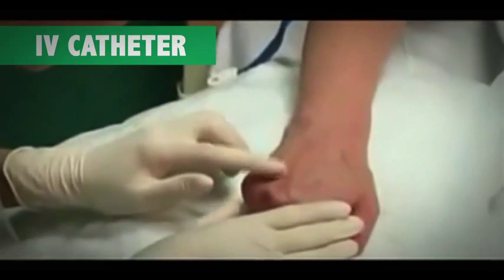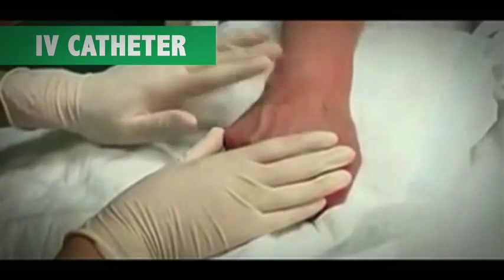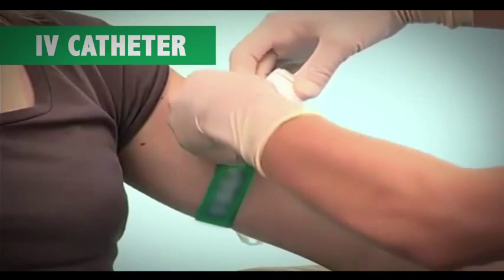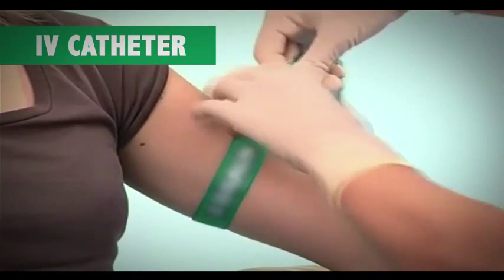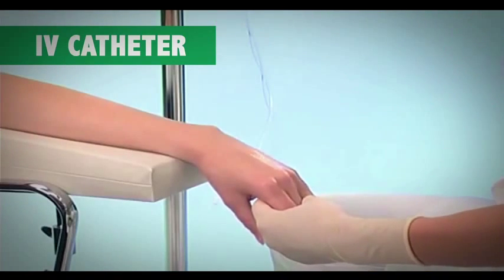Adjust the arm of the patient in a comfortable position and locate a straight portion of the vein. Apply the tourniquet to the arm and recheck the vein. Wipe the area around the vein with an alcohol swab.